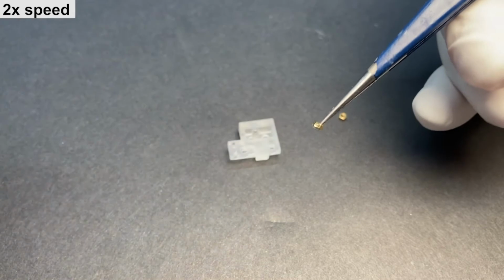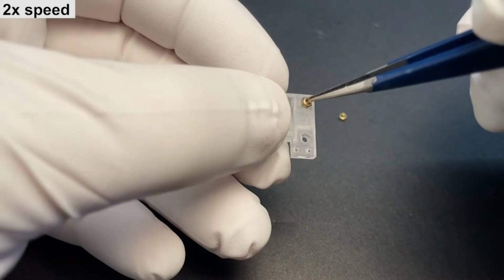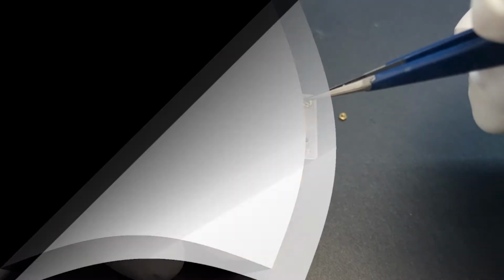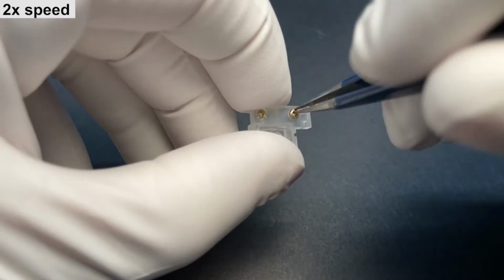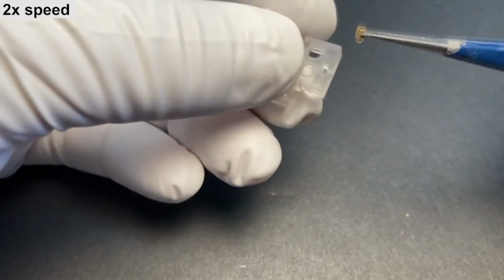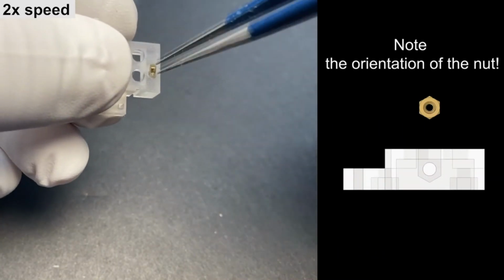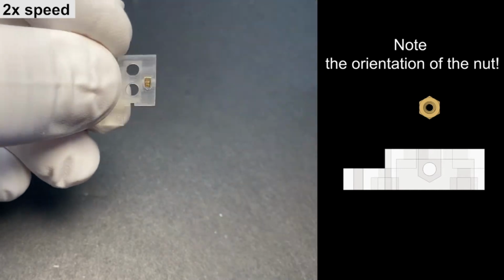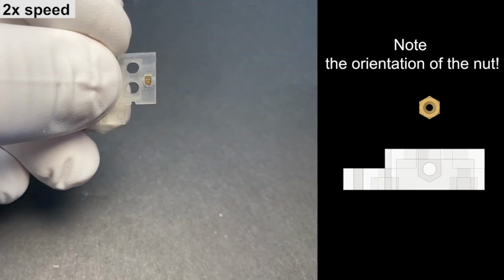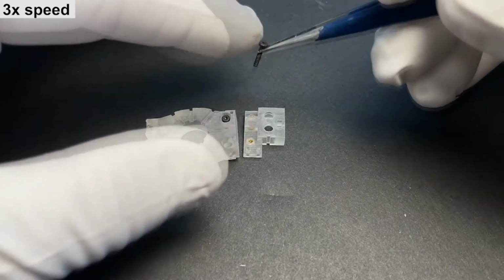And why we changed the original design to use so many nuts is the fact that here we will have a metal to metal connection instead of a metal to plastic connection. So it will improve the longevity of these components. So here again, please note the orientation, how you need to insert this nut. And then once these nuts are in place, then we screw these two pieces together.